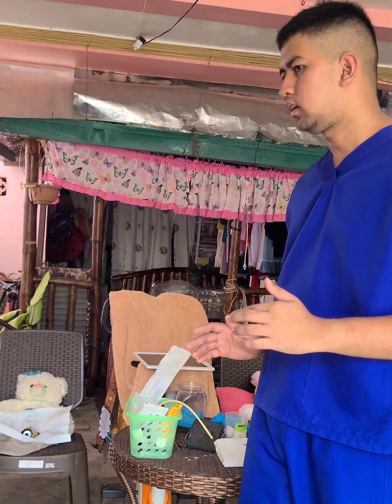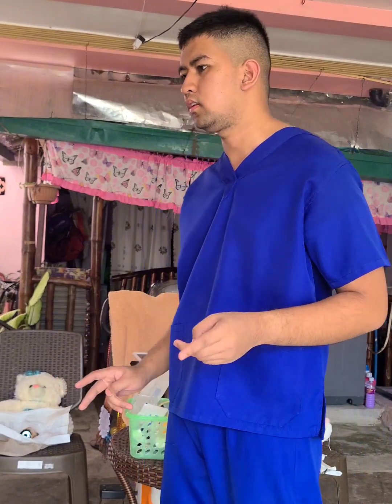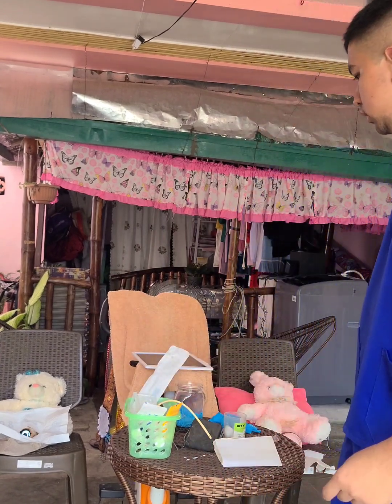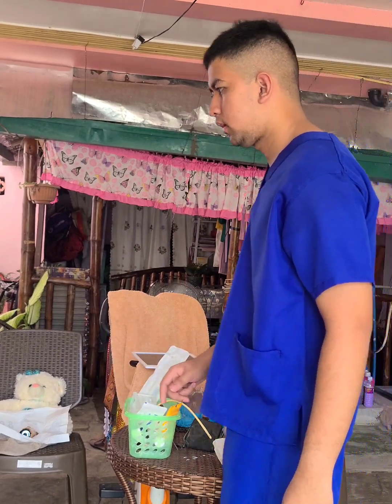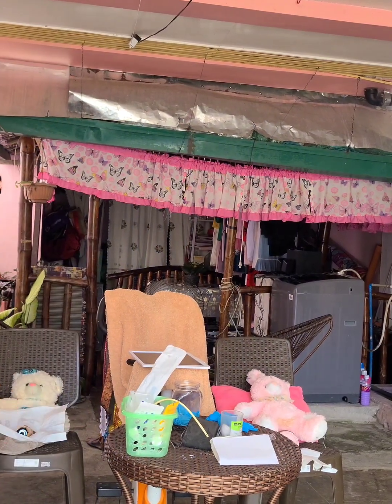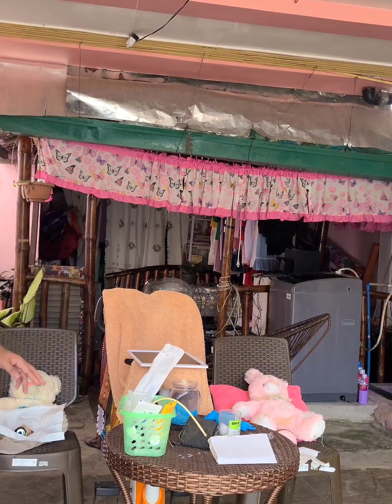So now we have performed hand hygiene and confirmed the proper rights, which is the right patient, the right medical procedure, which are two of the most important rights that apply to this procedure. We're going to introduce ourselves to the patient, and explain the importance and purpose of this procedure.